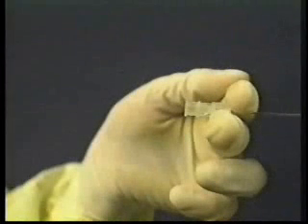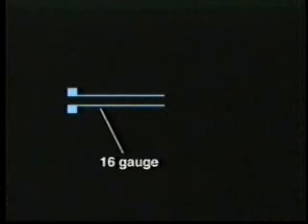What if you have an obese patient? Use the upright position if feasible. It will allow you to better palpate landmarks. It is possible that you will place the spinal needle all the way in and still not get CSF. Obtain a 16-gauge spinal needle to use as a guide. Seat it. Place the longer 18-gauge needle through the larger bore 16-gauge needle and proceed.